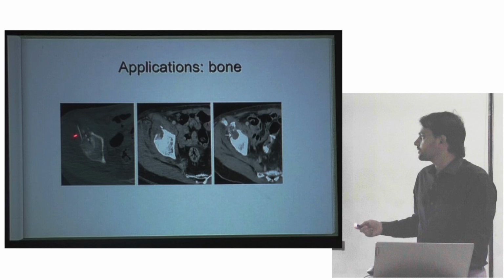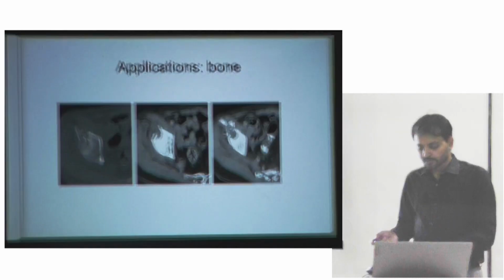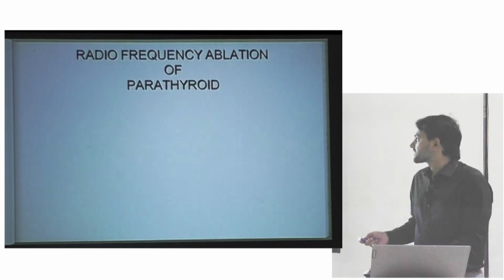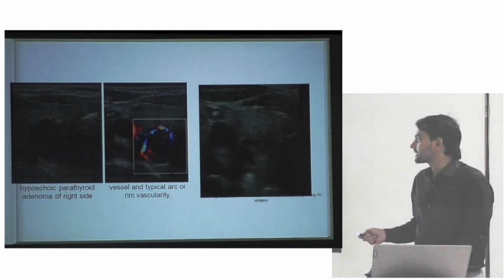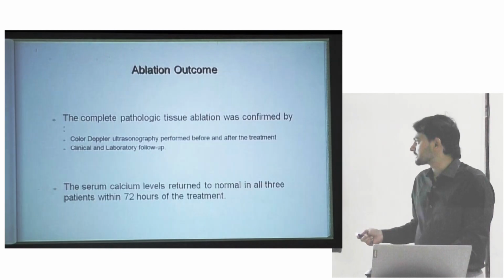So this is the deployed probe for a single solitary lesion, and these are the electrodes deployed. And in bone, especially osteoid osteoma, radio frequency ablation is another effective procedure. And radio frequency ablation of single solitary parathyroid adenomas will give beautiful results.